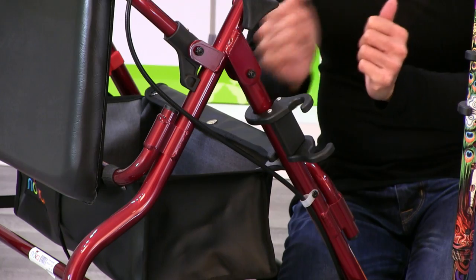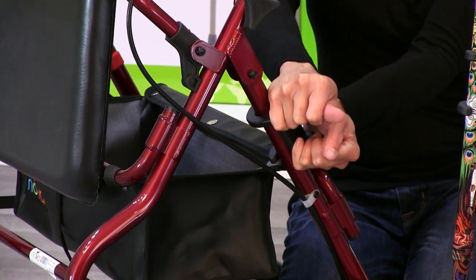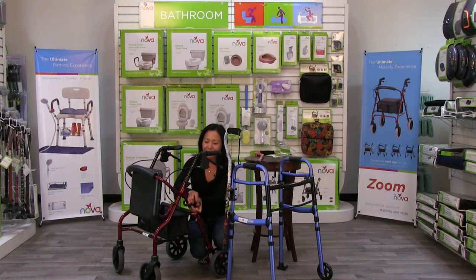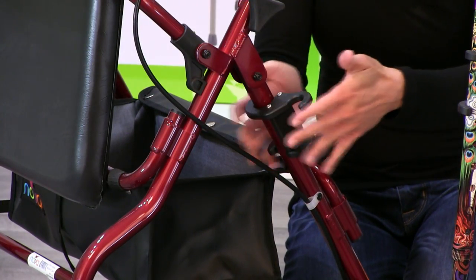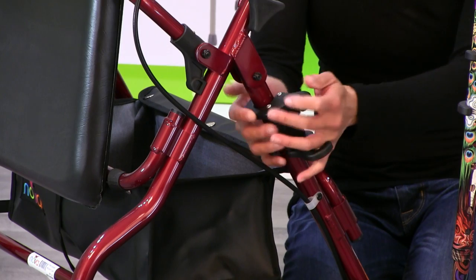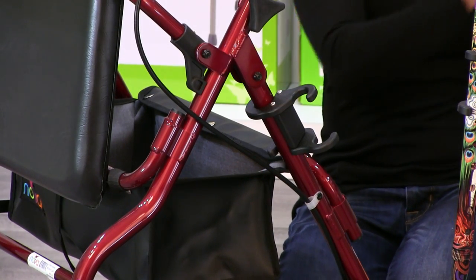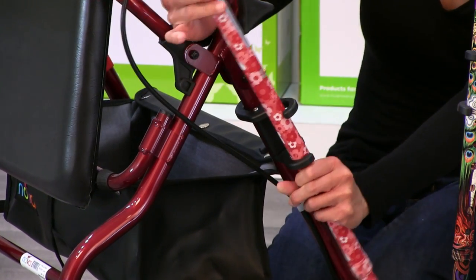Then just pull it in and you see it clamps in place — you'll hear that loud clamp. To take it off it's going to take some muscle, but I can do it. You may want to get a little assistance if you need it. But putting it on is really easy to do, and this plastic is high grade so it's not going to break — it will stay secure. Then you take your cane and just attach it like this.